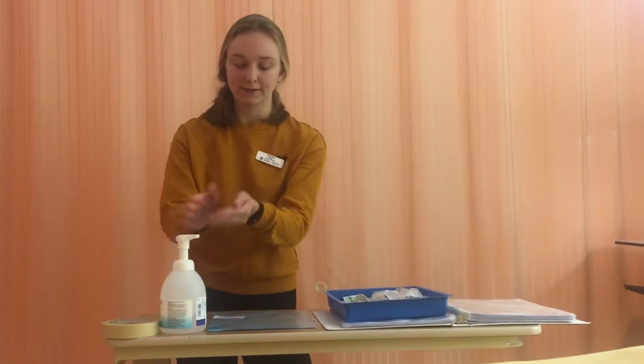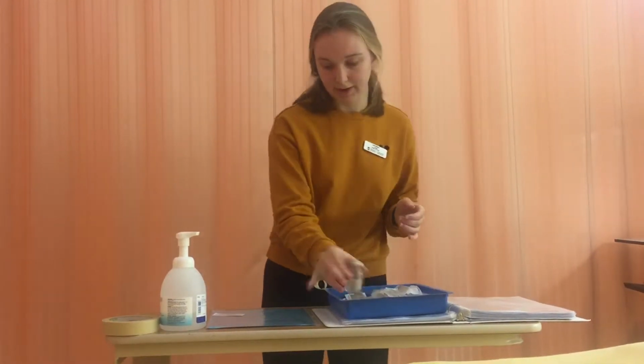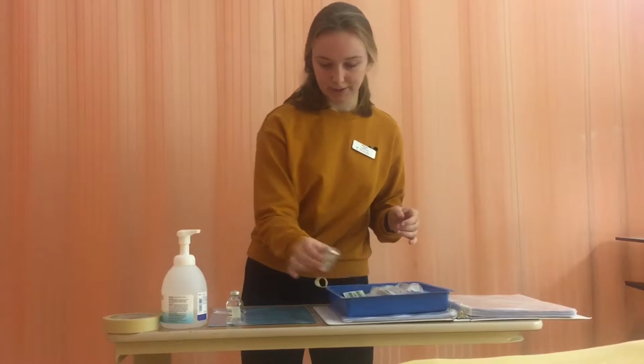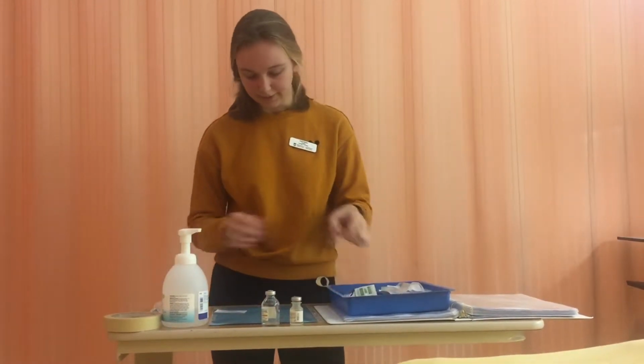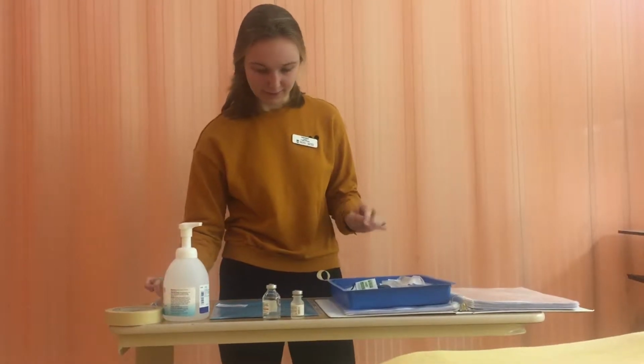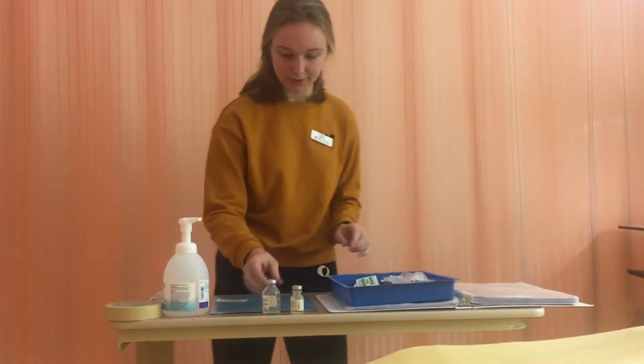So now I'm going to wash my hands. I'm going to gather my supplies. So I'm going to get my medication and my sterile water and my syringe and my blunt fill. So I have all of my supplies here, and now I'm going to do my first check.